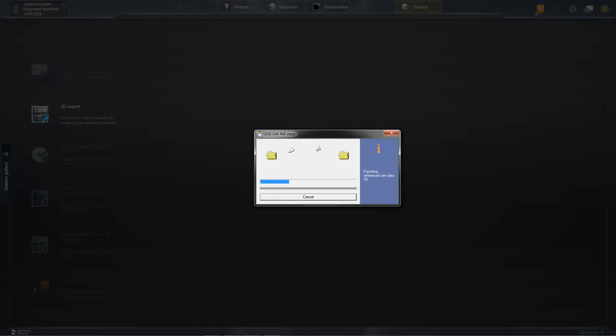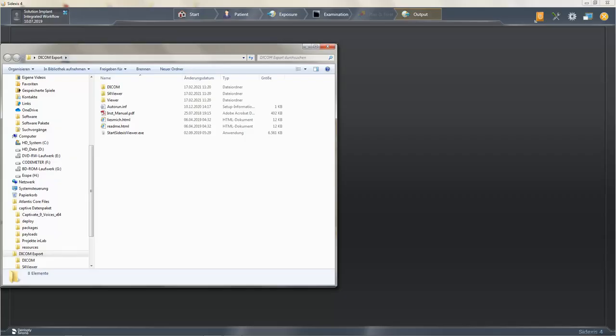After the download has completed, we open our folder again and you will find the exported data here, as well as the previously mentioned Sidexis Viewer.